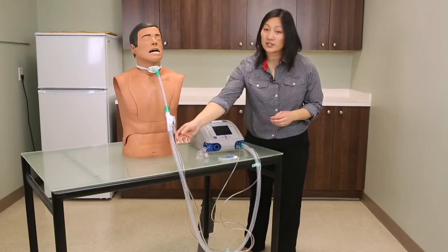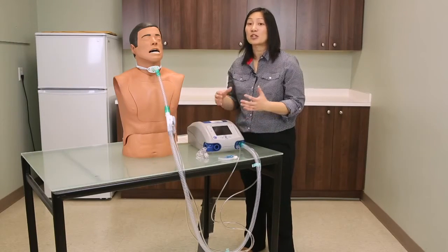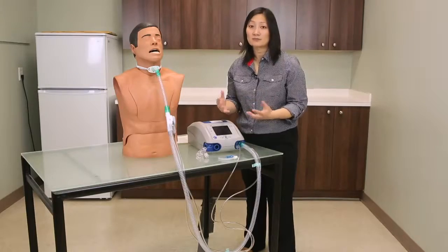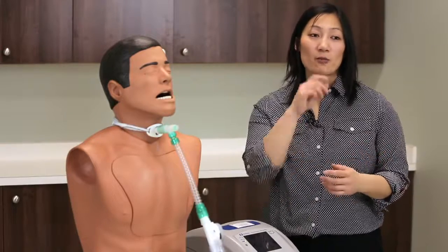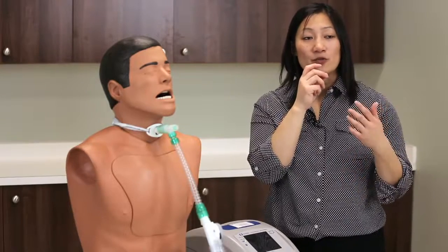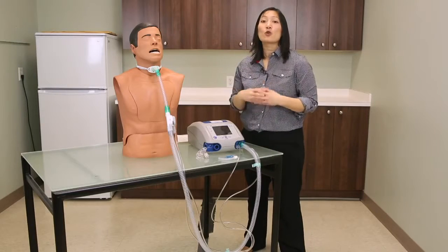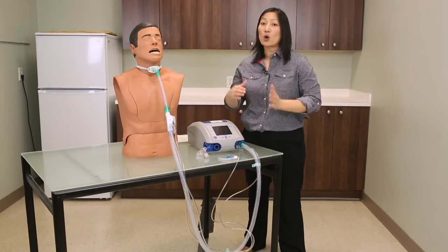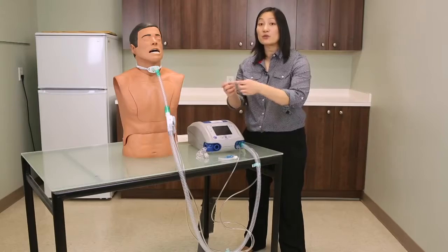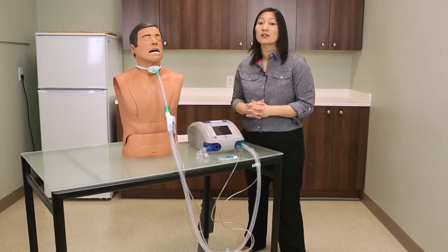The pressure is measured distally and in the ventilator, and is mistaken as pressure that can be delivered into the lungs. The best analogy is picturing yourself blowing through a small straw; the resistance or pressure that you feel is what is measured in the circuit. So if your low pressure alarm is set lower than the pressure being delivered through the circuit while it's not even connected to the client, the ventilator will not alarm.